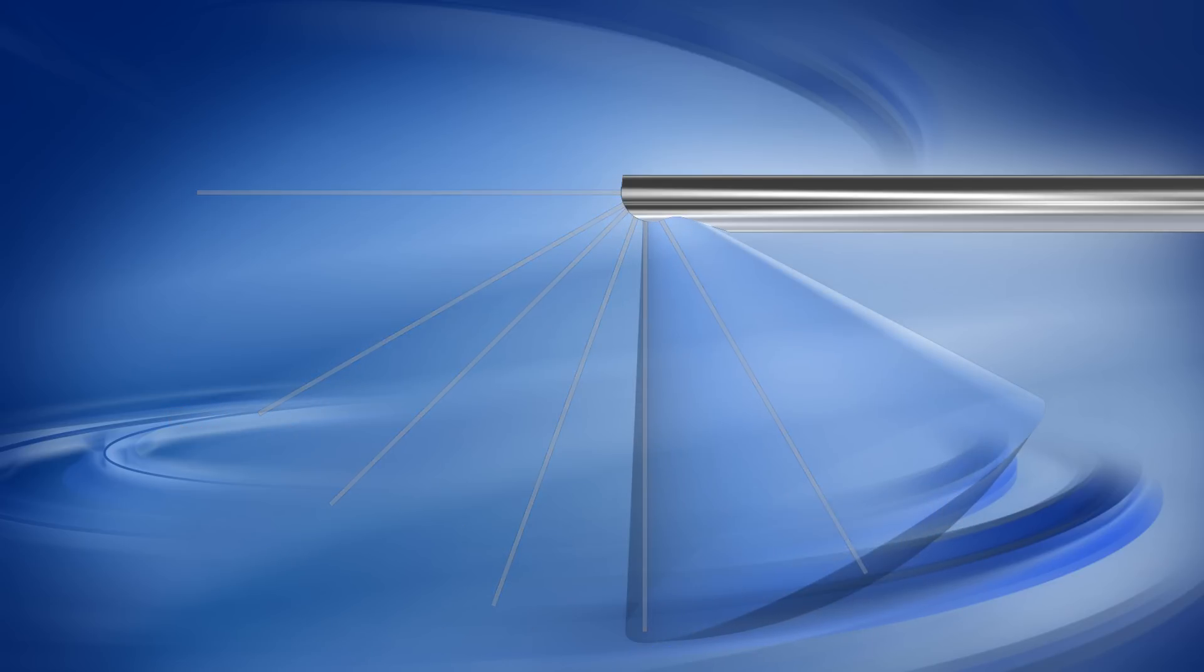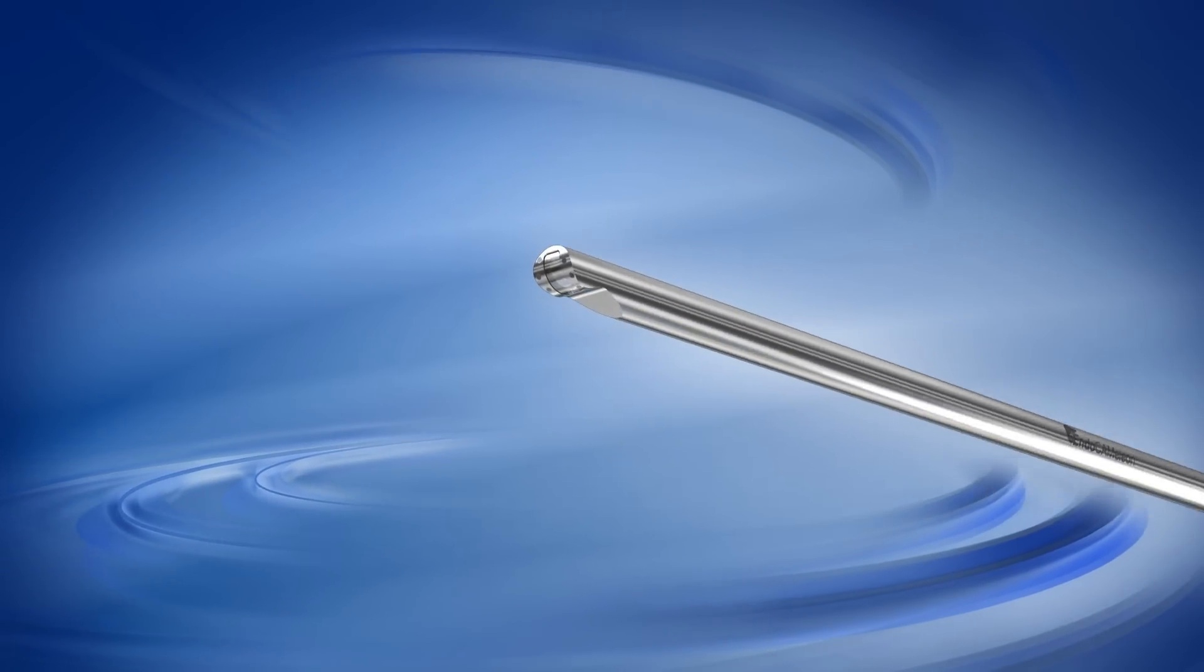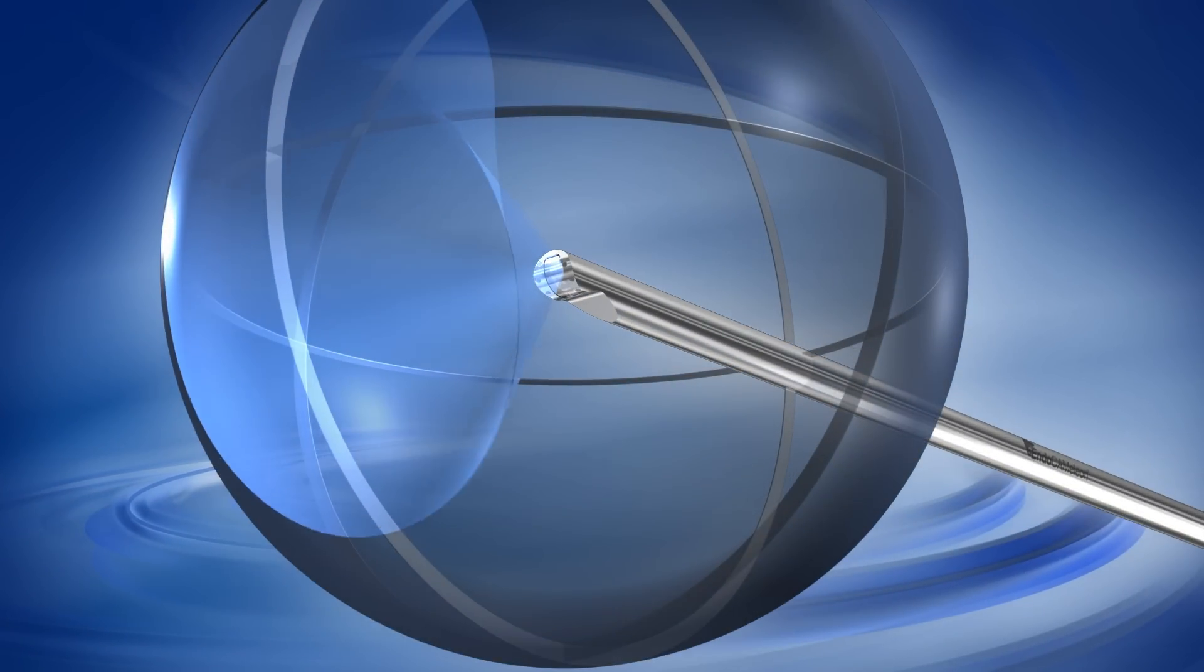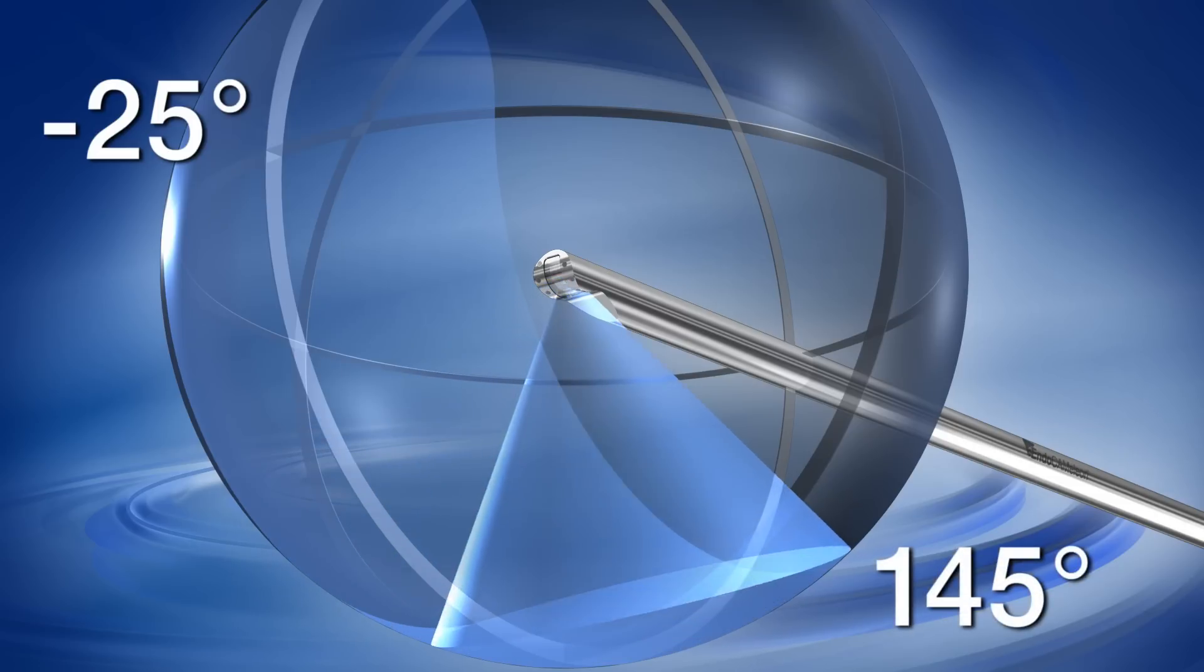The swivel range and approximately 55 degree field of vision of the EndoChameleon allow one to view an area infinitely selectable between minus 25 degrees and 145 degrees.